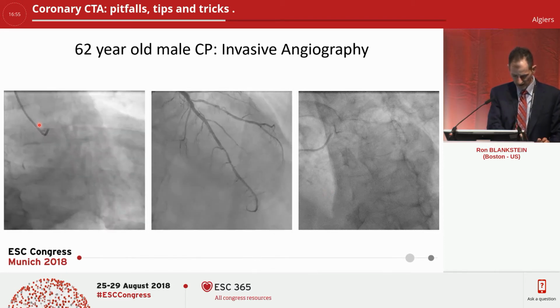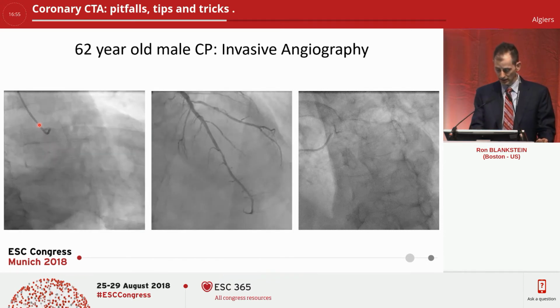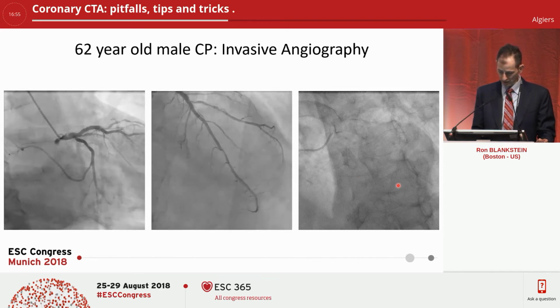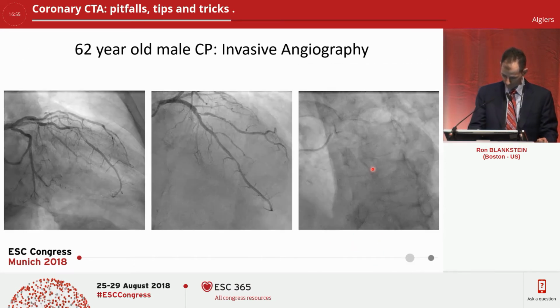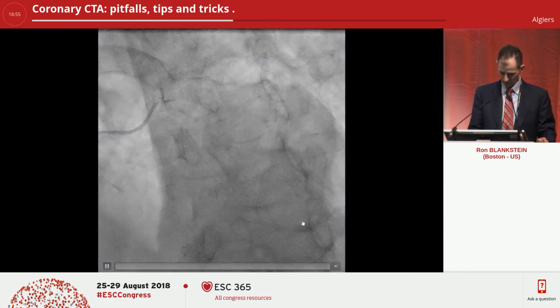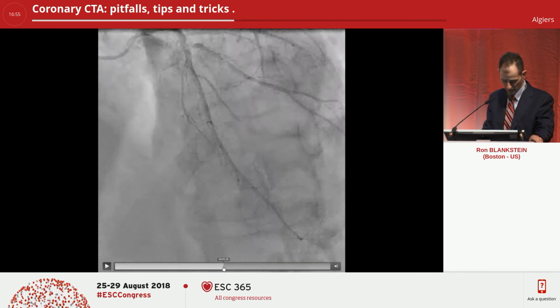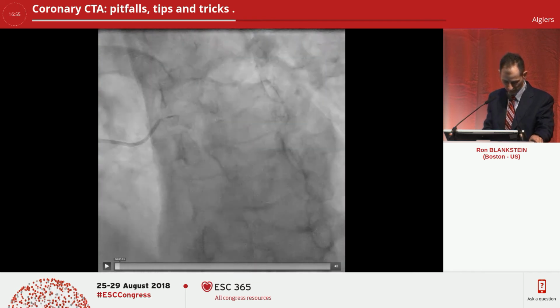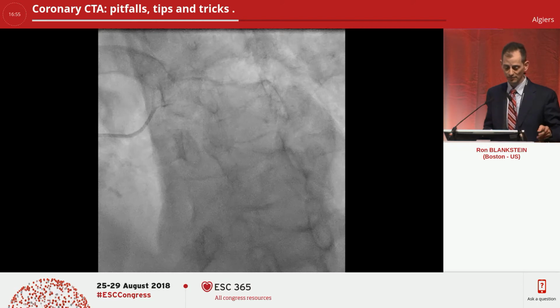a lot of plaque in the left main. You can see maybe that the catheter is angled, maybe I would say not ideally. And then when we look at the last shot in this particular image here, let's see if this works. So in this image right here of the left main, I think the most impressive thing is if I were to pause this and go to the very first shot, what you see is a contrast stain before you inject any contrast. So this is an angiography where we would suspect that this is a dissection.